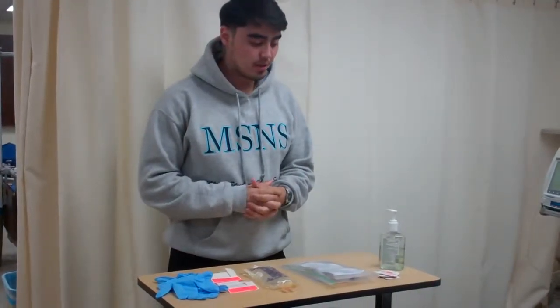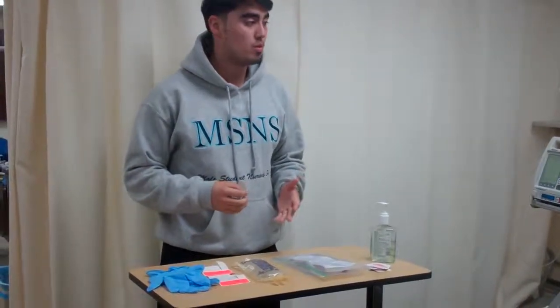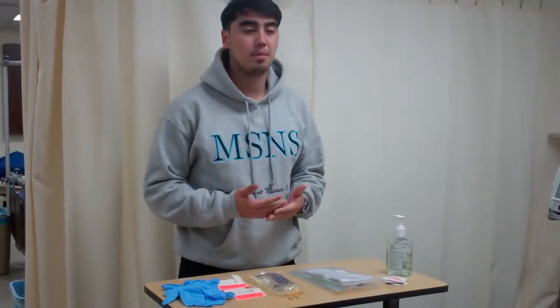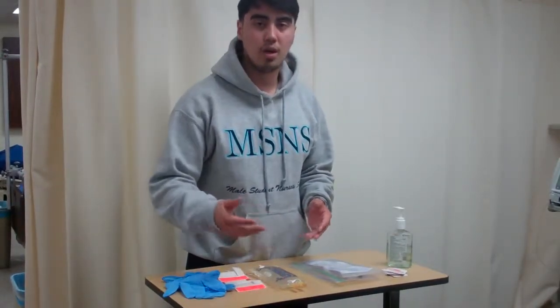So today I'll be administering medication via piggyback according to the physician's orders. Before we want to give the medication, the first thing we do is make sure that we have the proper medication, the proper volume, and the proper patient that we're going to be giving it to. So before we do anything, we want to make sure that we have our medication with us, and we're going to do 3 simple checks.